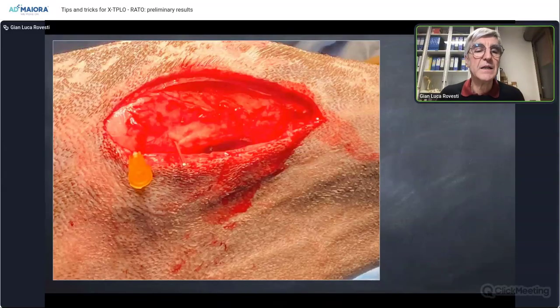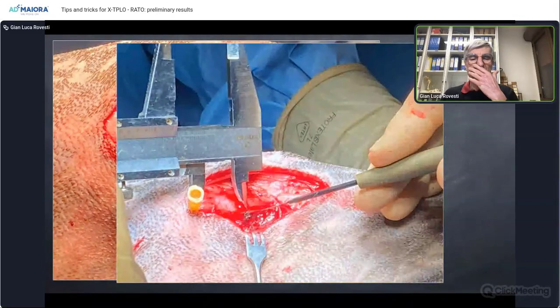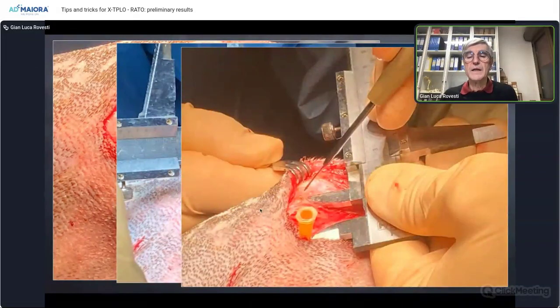So I have the insulin needle inserted into the joint. I will take the first measure, the distance from the center to the caudal cortex, and the second one, the distance from the center to the top of the tibia, always again the radius of the saw blade.